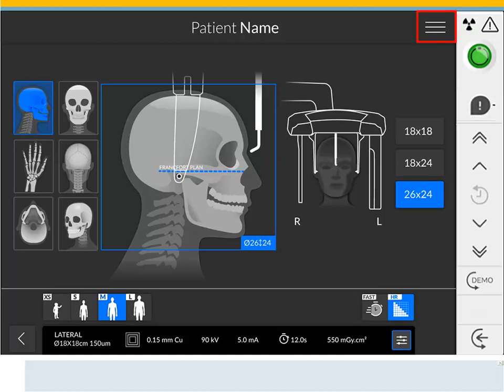Menu provides access to the following submenus: General Settings, DICOM Settings, Reset to Factory, Patient History, Shut Down, Restart, and About. All functionality, except for adjusting the unit height, can be performed from the touch screen control panel and from the workstation interface. Both display error messages and operating parameters.